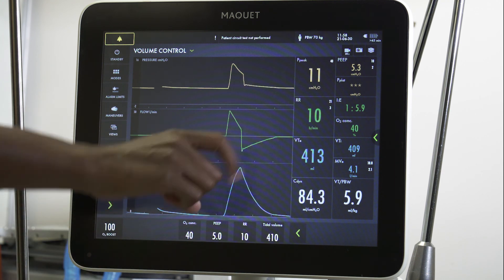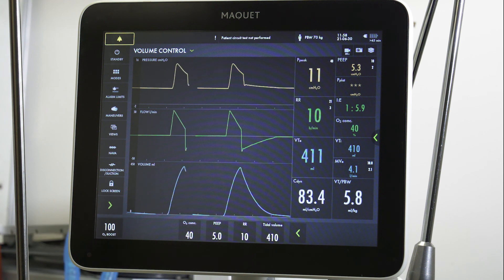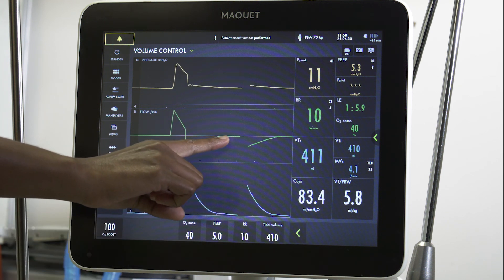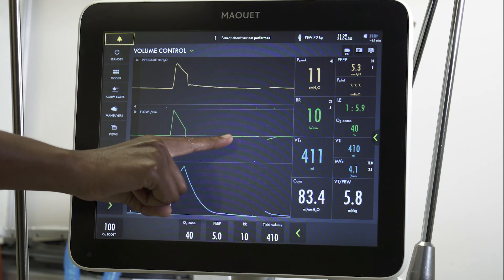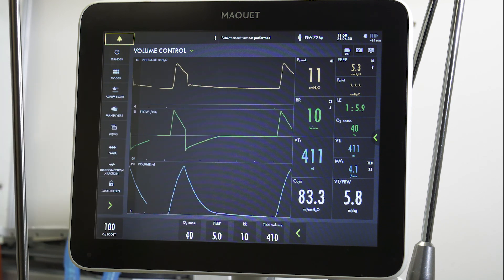As you can see here, this expiratory flow line returns to zero before the next breath is triggered by the ventilator. If it does not, you will suspect auto PEEP.